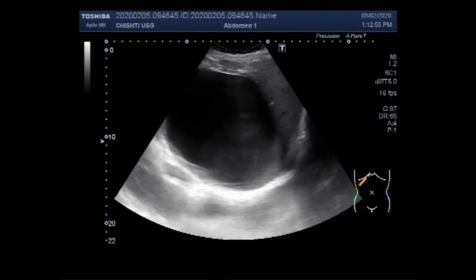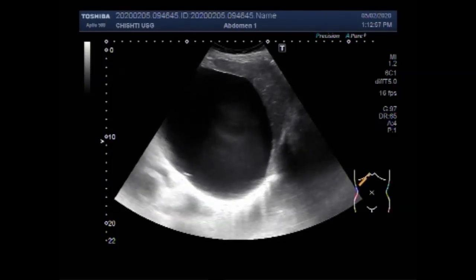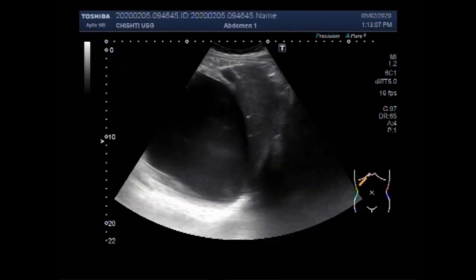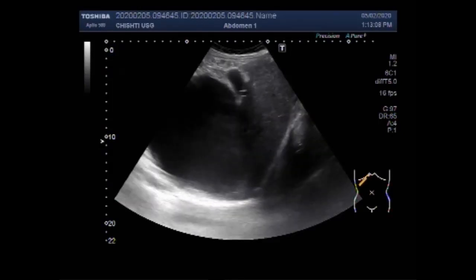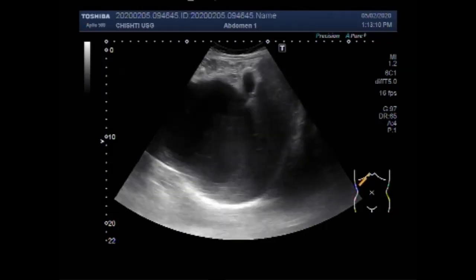Hepatic cysts may show posterior acoustic enhancement if large enough. A few septa may be visible, but there should be no wall thickening. A small amount of layering debris is a possibility. There is no internal vascularity on color Doppler.